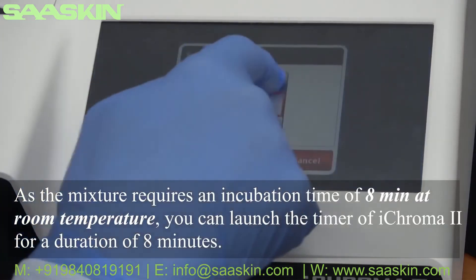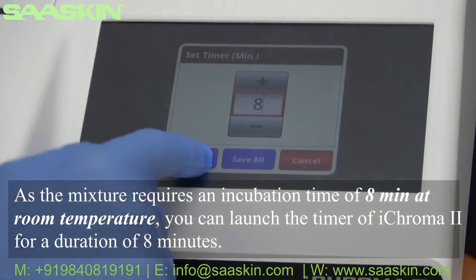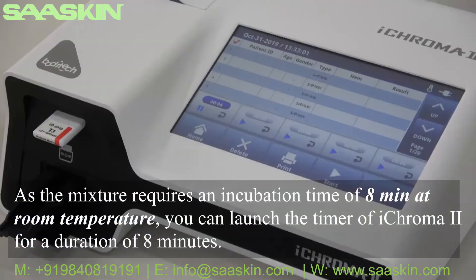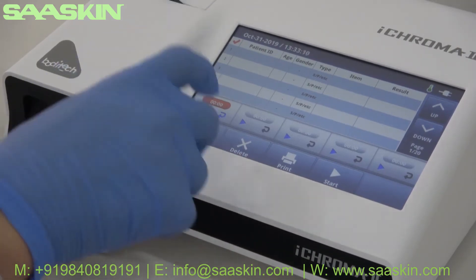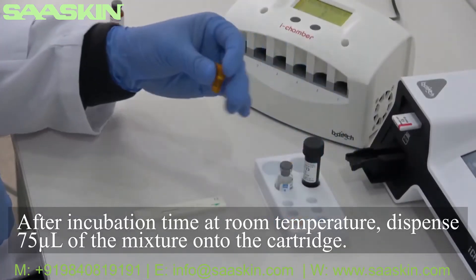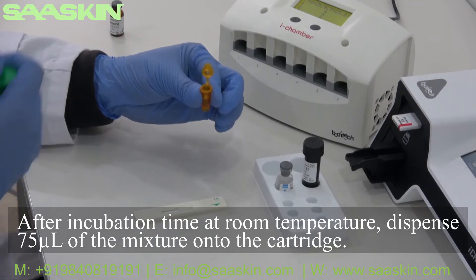As the mixture requires an incubation time of 8 minutes at room temperature, you can launch the timer of ICHROMA 2 for a duration of 8 minutes. After incubation time at room temperature, dispense 75 microliters of the mixture onto the cartridge.